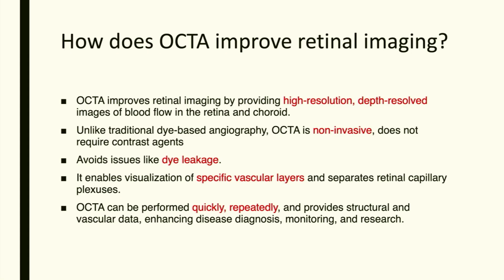It is depth resolved. Now, fluorescein angiogram takes care of only one surface on top, which is the superficial one. It does not show you that there is a deeper layer and there is vascularization under that layer also. It does not show you any of that. It does not show you how the choroid is opaque, how the choroid capillaries is opaque. So all those things are seen separately in OCT angio. And once the dye starts leaking, it obviates all other details.